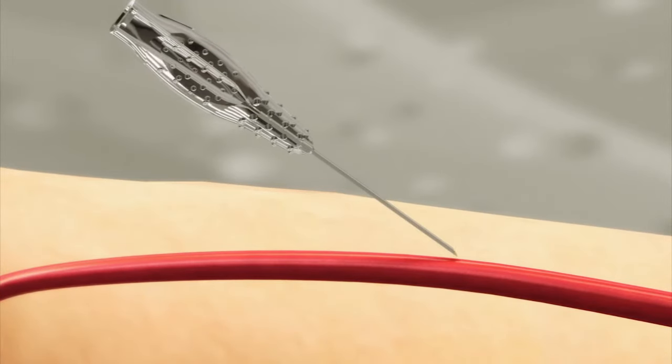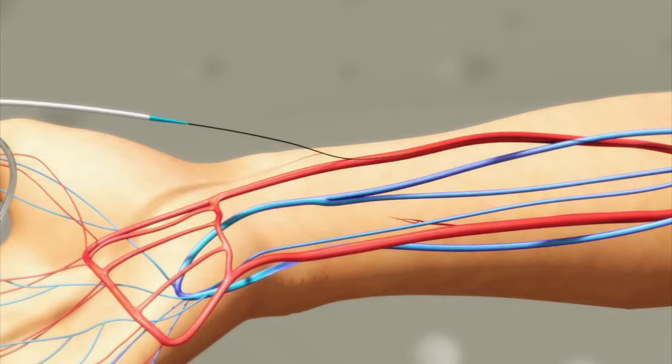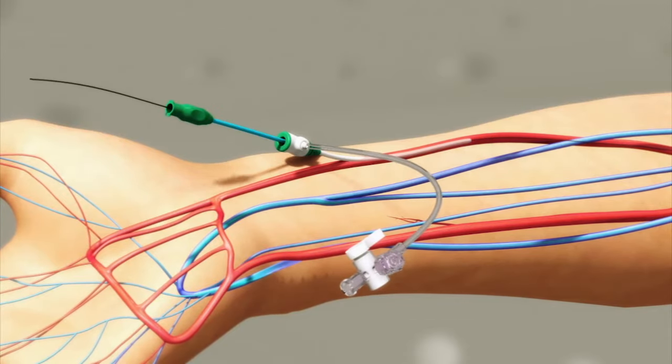Then a tiny puncture is made, and a short tube called a sheath is inserted gently into your artery.